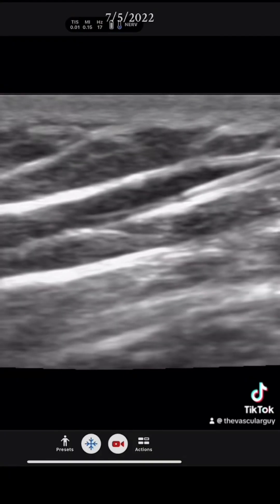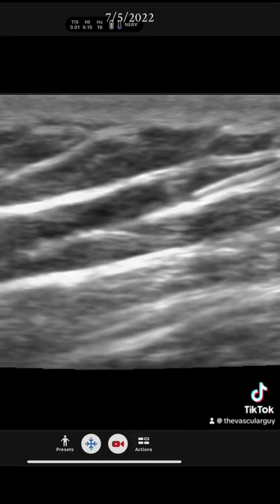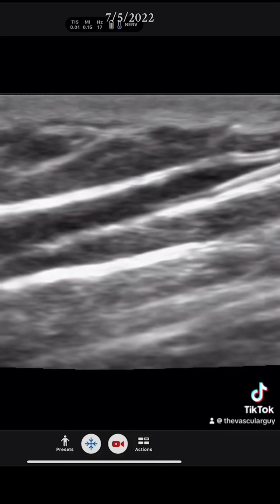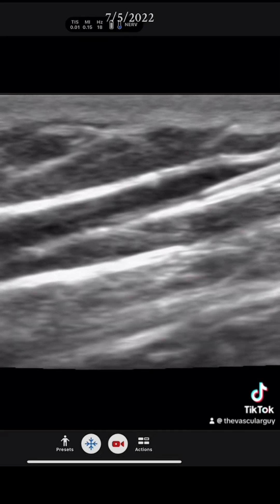Here I'm flushing very gently, very slowly, and you can see the saline coming out of the catheter. With this slow flush, slow push, you can see very little disturbance in the vein.